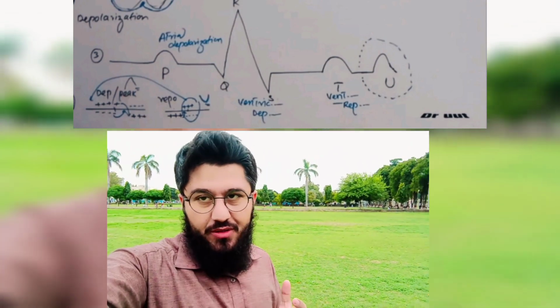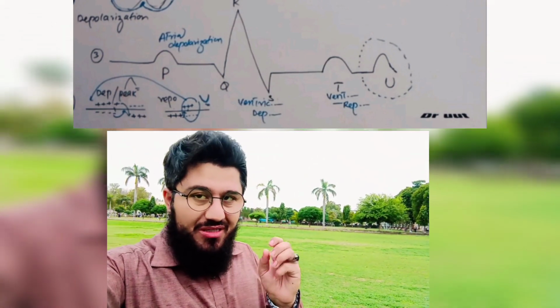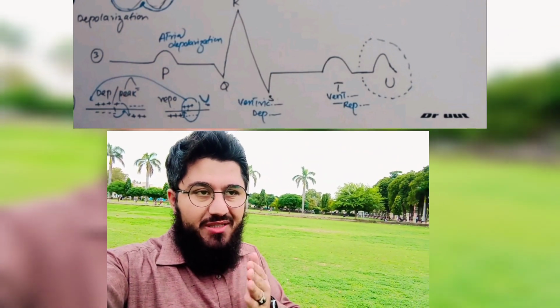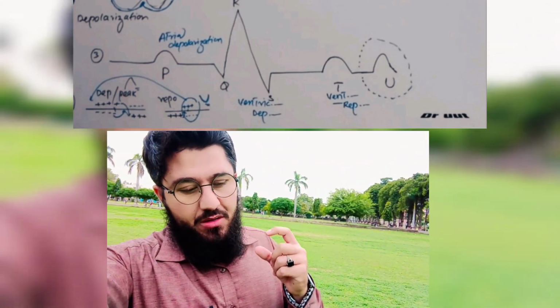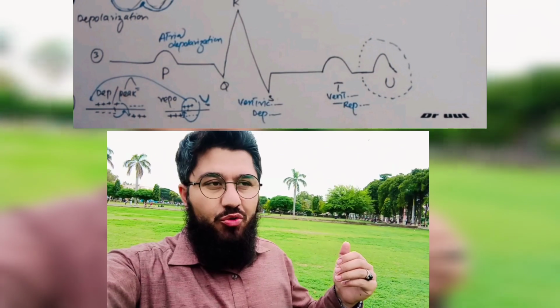First of all, the question and the answer to the question is actually in the complete video. The question: on standard ECG, we just see three waves. There is a fourth wave, but the question that I'm asking you is actually about the wave that is missing between these three waves. Number one, atrial depolarization. Number two, ventricular depolarization. Number three, ventricular repolarization.